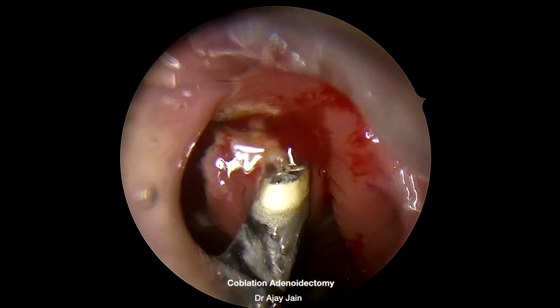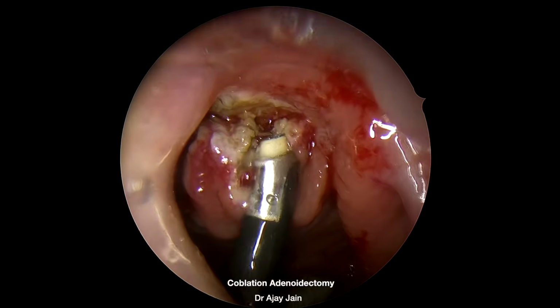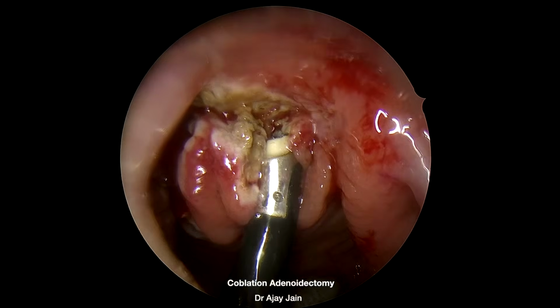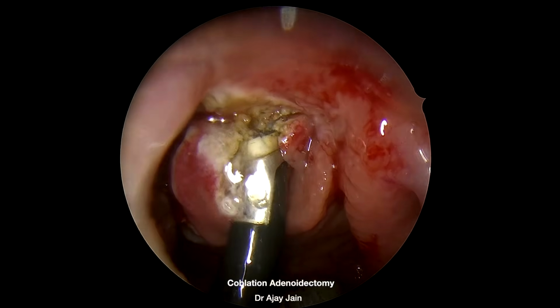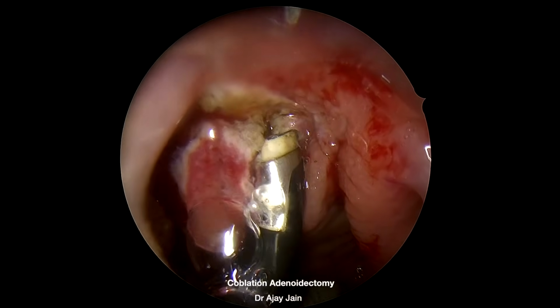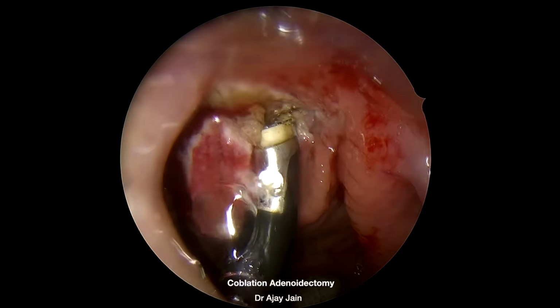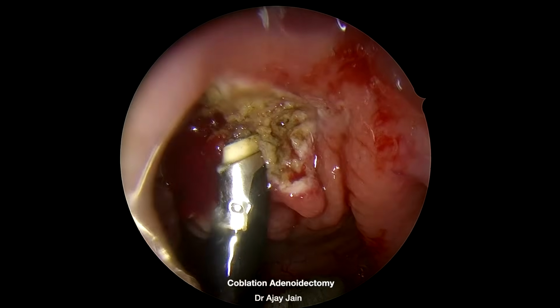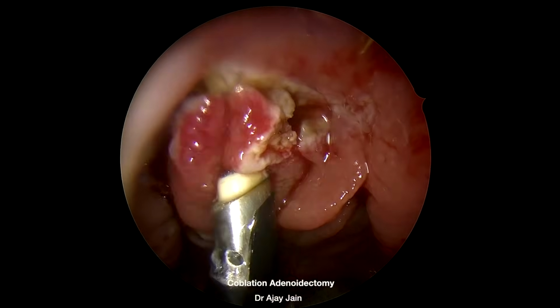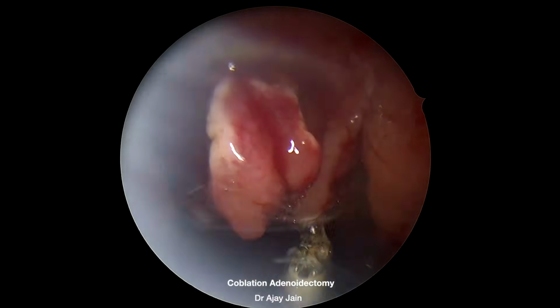Small bleeding points are dealt with immediately before proceeding further. First suction, then apply the cautery after identifying the bleeding points. This disposable wand costs approximately 25 to 30,000 and is generally intended for a single procedure. Proper handling, continuous irrigation, efficient suction, and careful cleaning of the system significantly improve its performance throughout the operation.